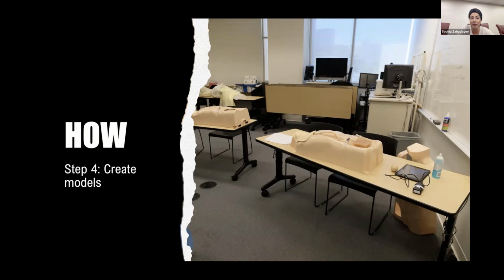We went through many iterations of the model because they'd done less ultrasound models and done lots of sim models. And so it was really challenging to find what I alluded to earlier, what looked good under ultrasound versus what looked good in real life. We were able to use these plastic models that they had set up for central lines in the femoral region, which was perfect because that's the same region where we're doing the fascial iliaca block.